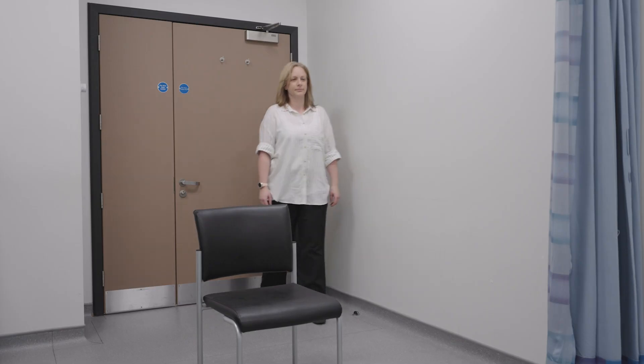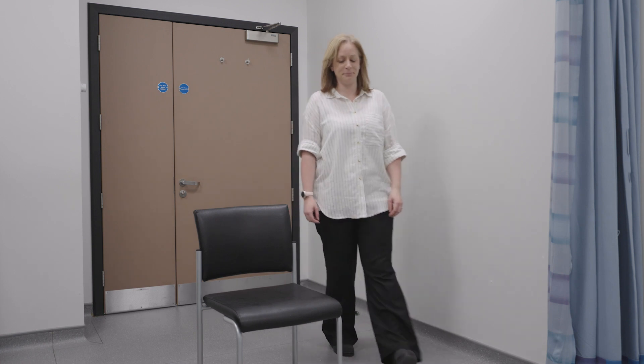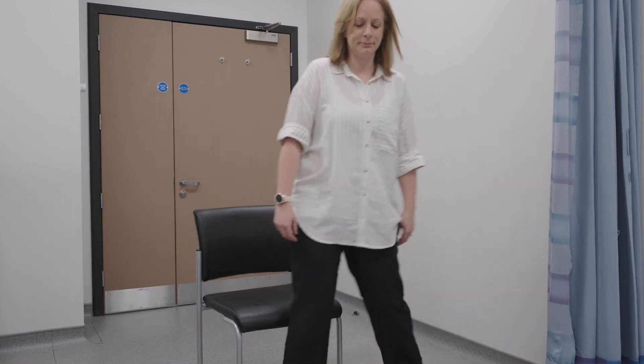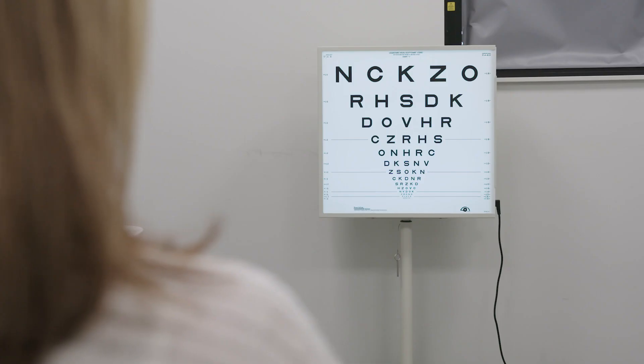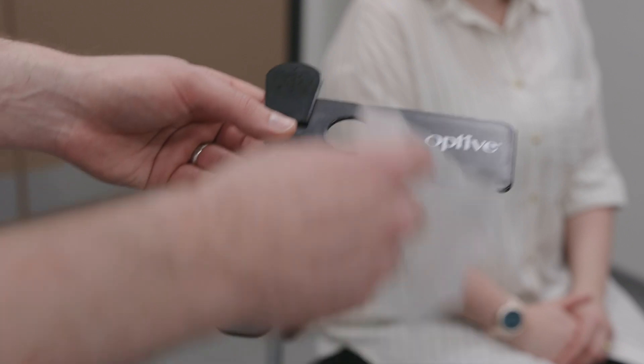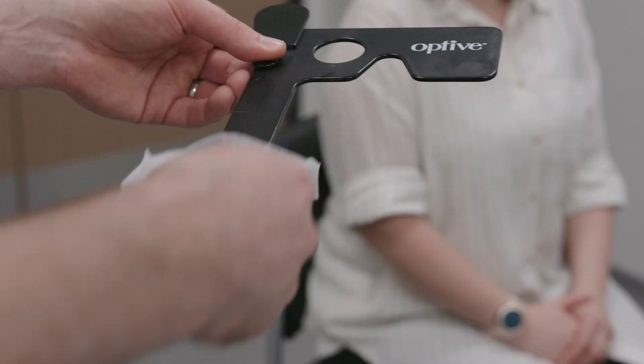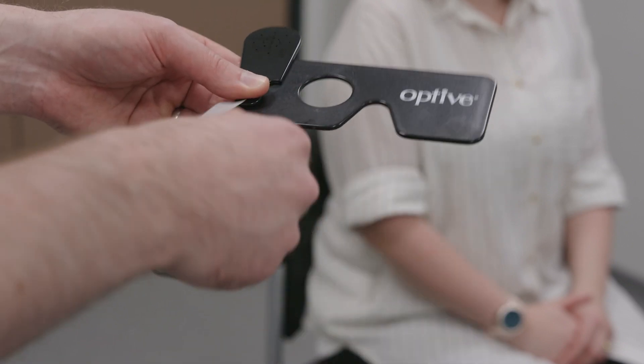Patient Setup: When performing the test, the patient should be sat upright, not leaning forward in the chair. The patient should be encouraged to maintain a steady head position during testing. The patient should be provided an occluder so that only one eye is tested at a time.